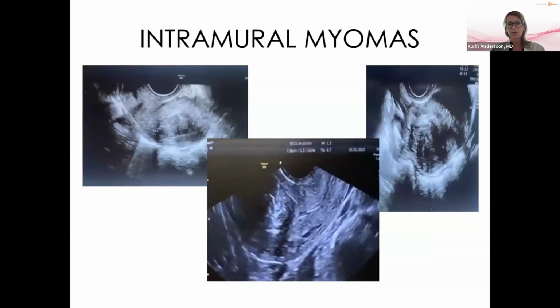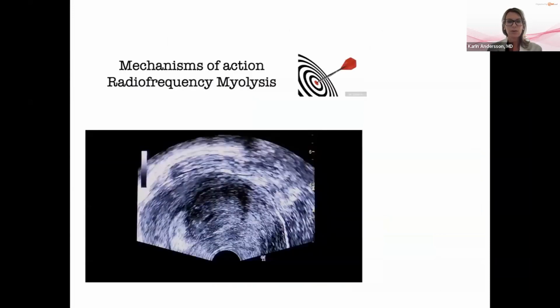And you see during the procedure how the echogenicity in the fibroid changes. It's easy to follow the needle. It's not a complicated insertion at all. They perform very highly. They are cutting the tissue very easily, so it's not difficult to follow.